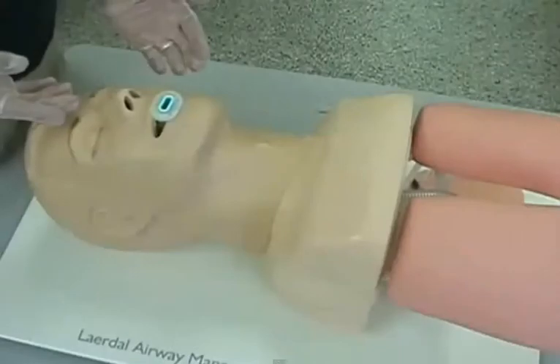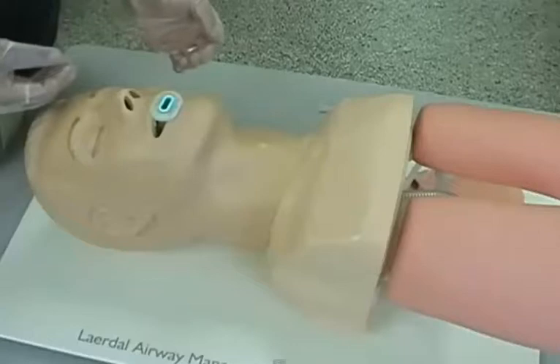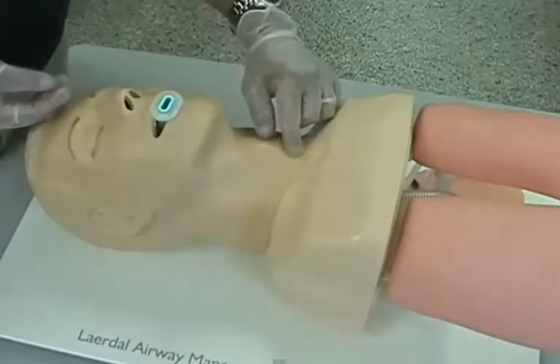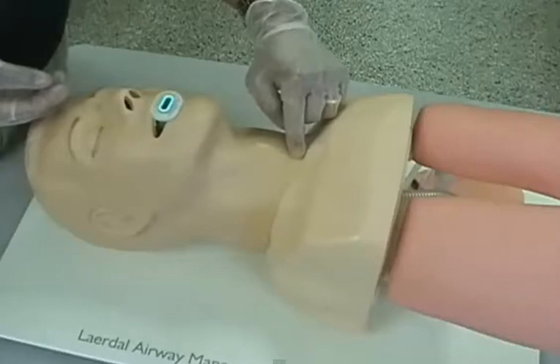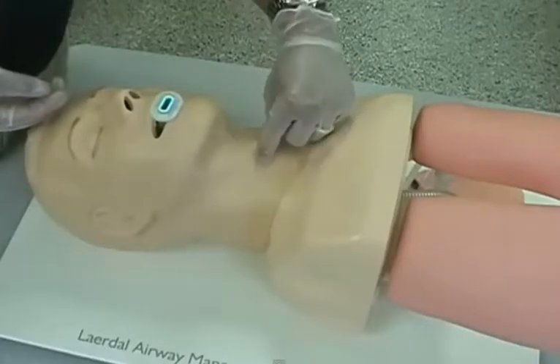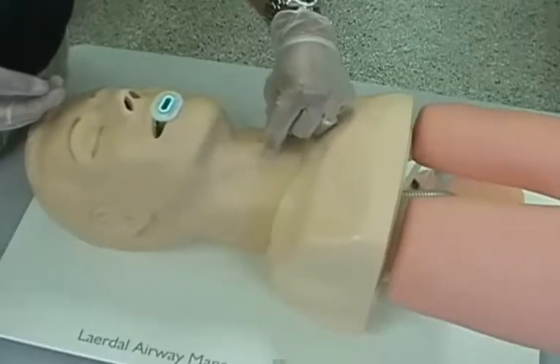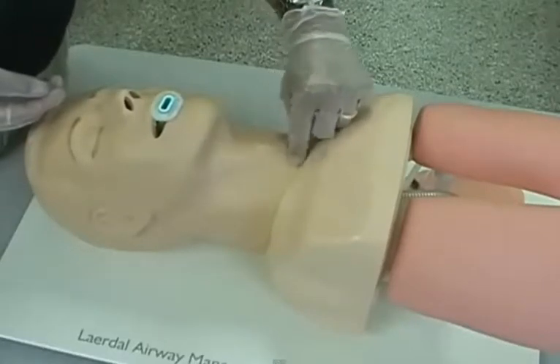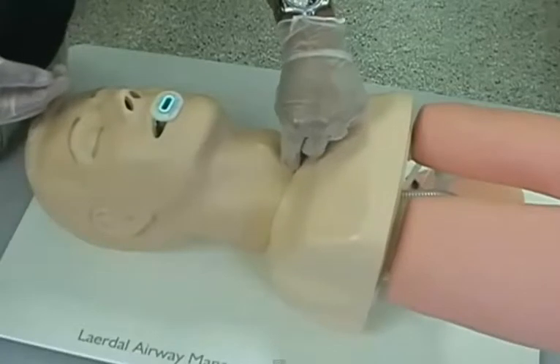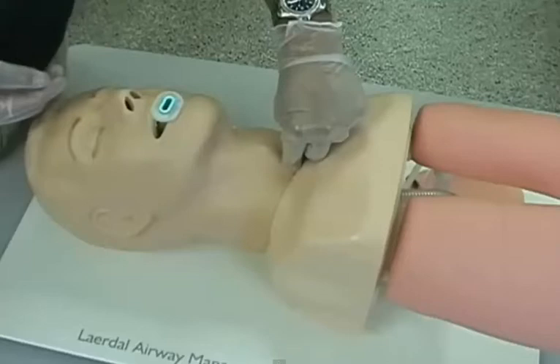When a patient's being ventilated, one of the techniques to reduce the risk of aspiration is known as cricoid pressure. Cricoid pressure is done by applying some posterior pressure on the cricoid cartilage. Now a lot of people get this mixed up. This is the larynx, this is the laryngeal prominence, or the Adam's apple. Just below that, the next hard structure is actually the cricoid cartilage. This is where pressure is applied in order to squeeze off the esophagus and reduce the risk of aspiration.